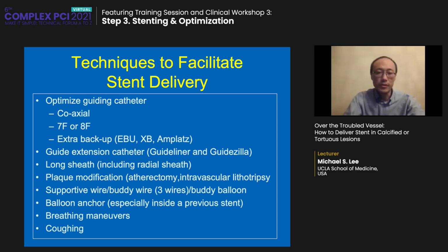One of the game changers in interventional cardiology has been the introduction of the guide extension catheter, like the GuideLiner or GuideZilla. This is extremely helpful in very tortuous or angulated vessels which require a little extra support to deliver the stent.